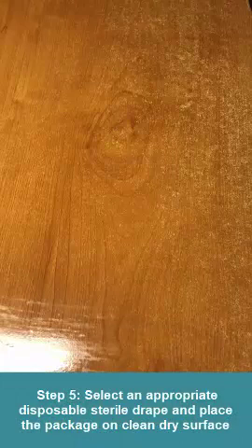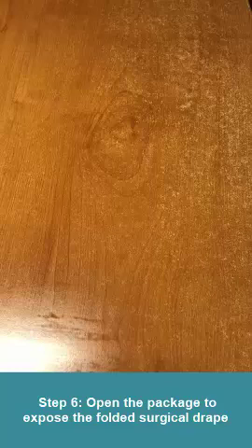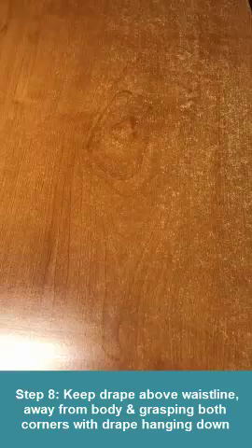I've got absorbent towels. Here I'm going to use for the sterile pad and the pad cover. So we're moving these, careful not to touch the sterile portion of it, just picking up the edges only. I can't let it touch my table until it's ready to be dropped onto the surface.